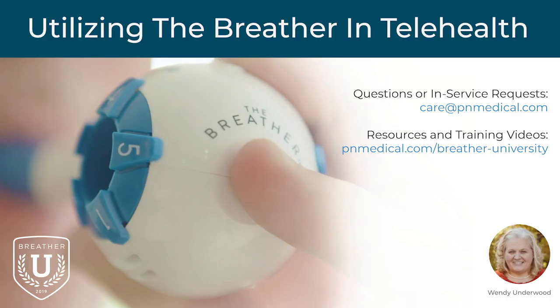So another demonstration on how to incorporate this in your telehealth visit. Again, it would be part of the visit when you're collecting all of that good information to give that progress report. We had me stand during the video, and you can see where I compensated and she caught me and how I was using my resting hand. You can have them seated. Most likely your client will be seated. And you can have them adjust the camera so you can see everything.